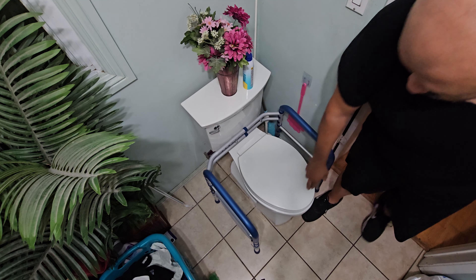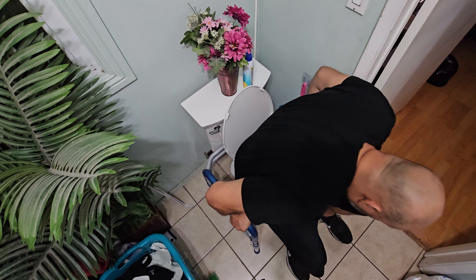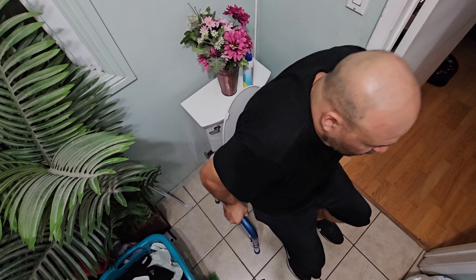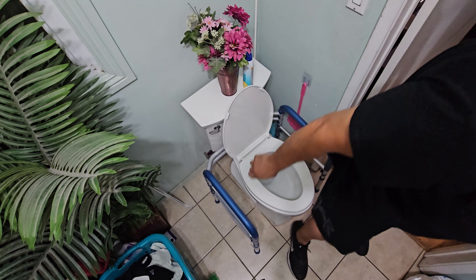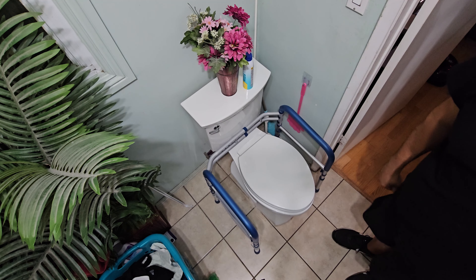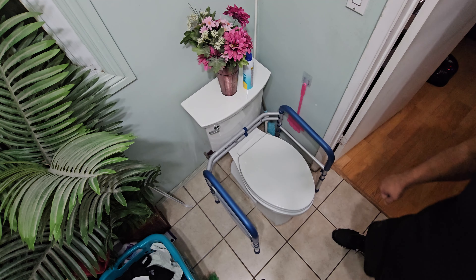Let me demo how it works. Open the toilet, grab onto the handles, and sit down — simple. When you want to get up, you can push up from the rails. The toilet seat doesn't hit the actual bars. Very simple and easy to use — I hope you enjoyed the video.